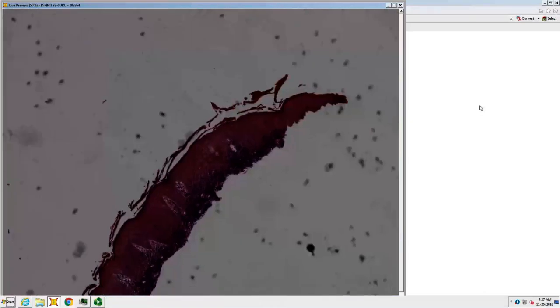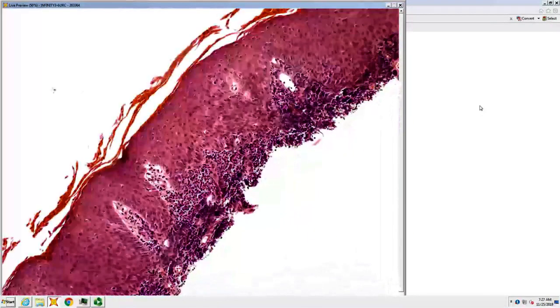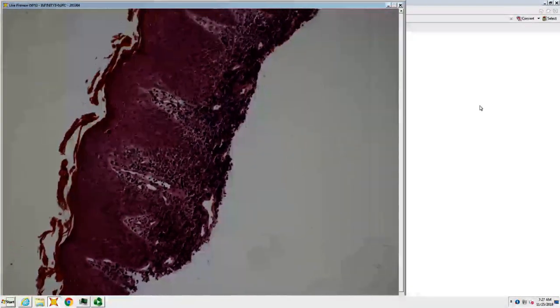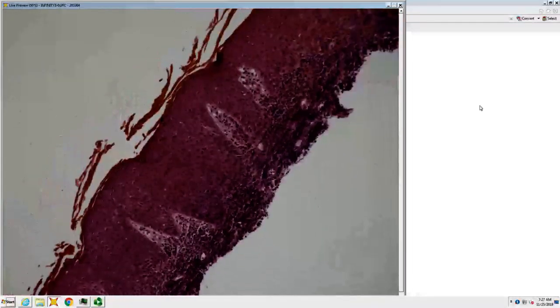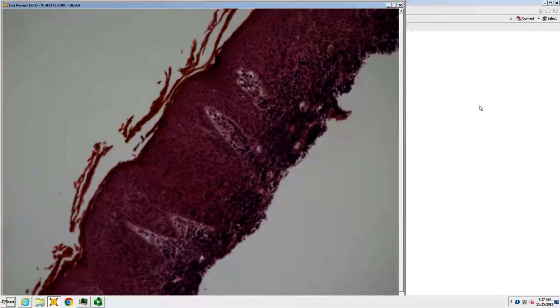Like wart. Yeah, like wart, HPV. And if this is genital, and you're already getting a little bit of epithelial disorder, this is one where you would follow the patient for the possibility of Bowen's.